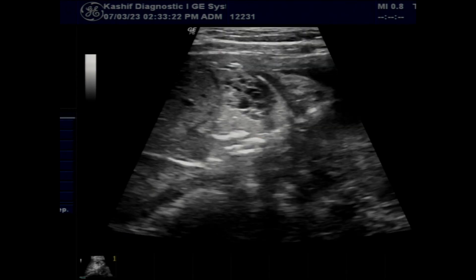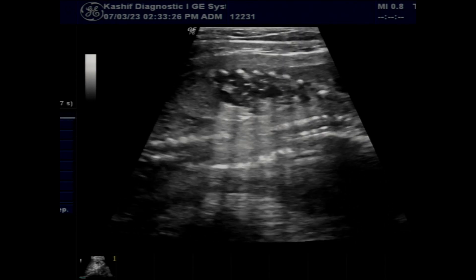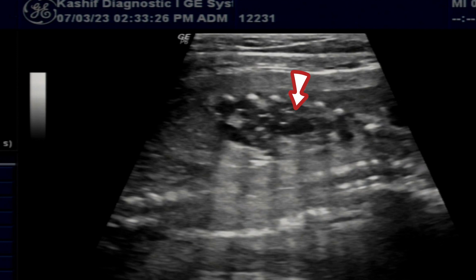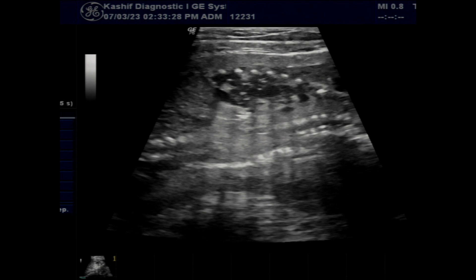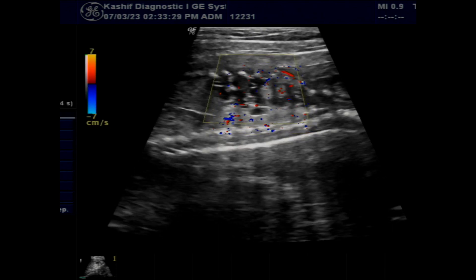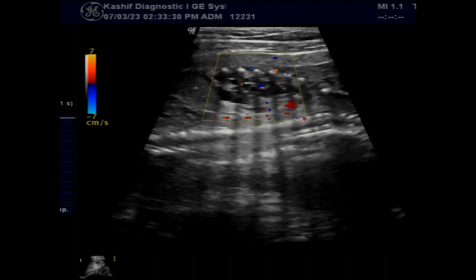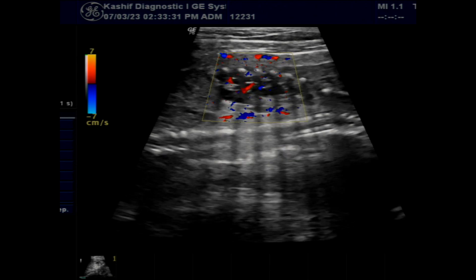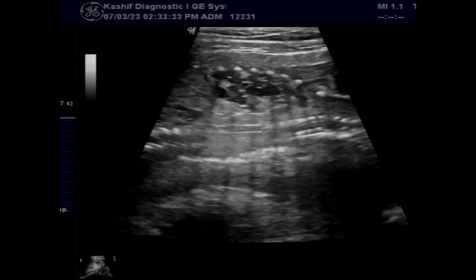This is a case of congenital cystic adenomatoid malformation. These are multiple cystic areas involving the right lung of different sizes. The largest is 22 mm. Some mass effect or pushing effect is also seen.